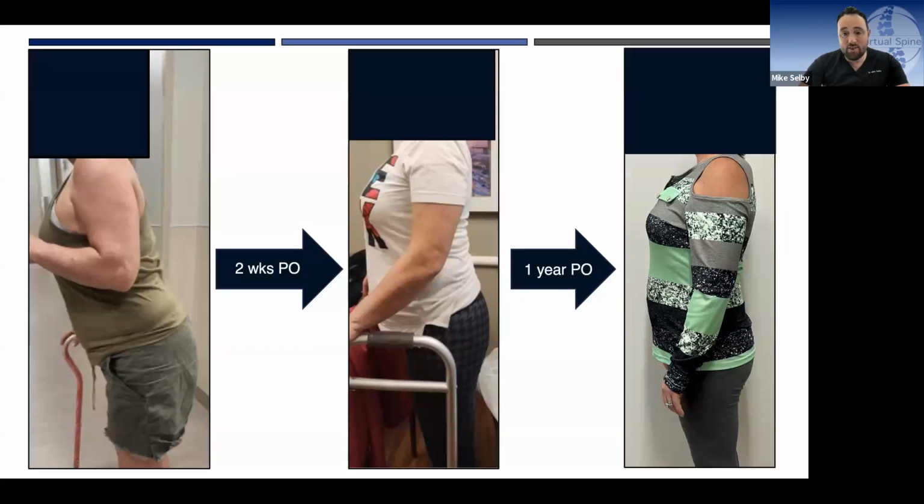I mean, a lot of spine surgeons look at these things and just go, they're horrible, get it out of there. But I think if it's an MRI compatible one and you're not operating directly in the area, it can be occasionally good to leave it in. Oh yeah, for sure. And my bias is to leave it in if I can. And the patients sometimes request it too, especially if it's been working for them, they want to keep it. Yeah. Rodrigo Amaro just mentioned it's a beautiful case. So I think most of us would agree with that.